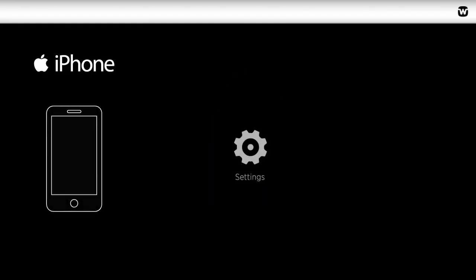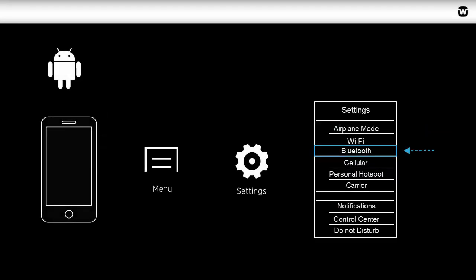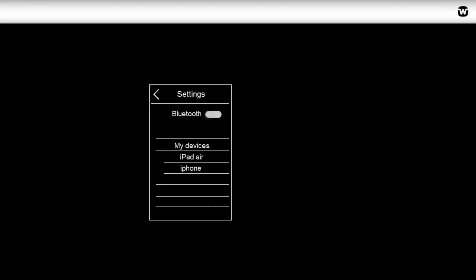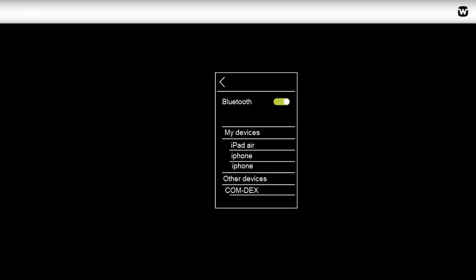Begin by making sure the Comdex and mobile phone are within a 1 meter or 3 feet range. The Comdex must not be charging during the connection process. Now connect the neck loop on the Comdex. It will not connect if the neck loop is open. The device will blink red and blue.